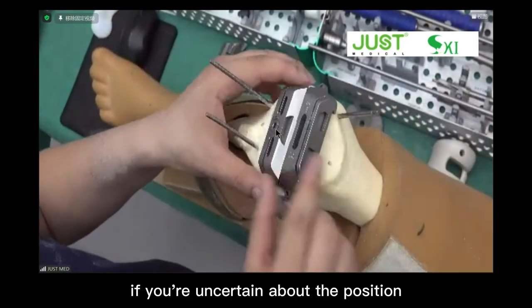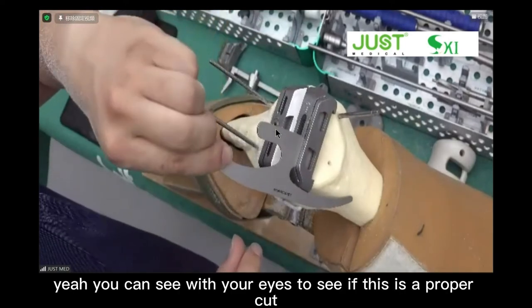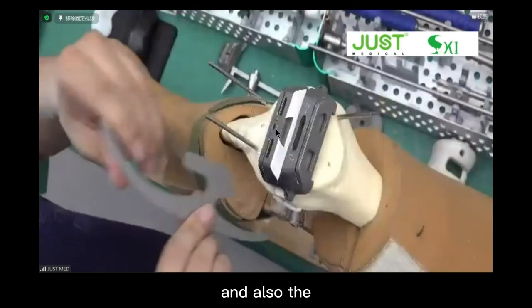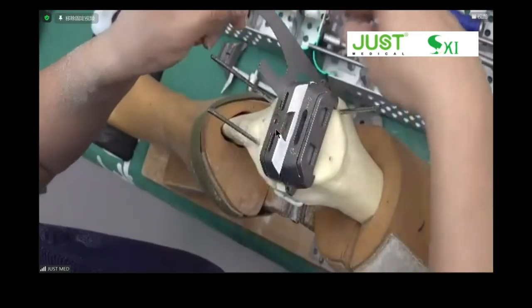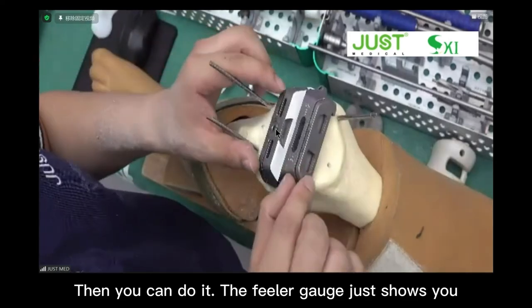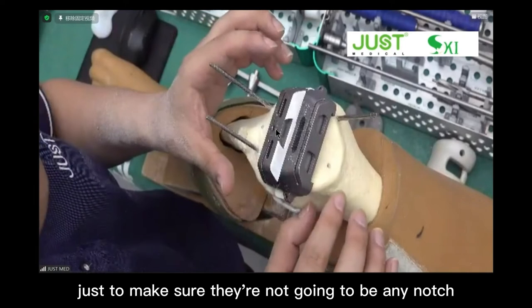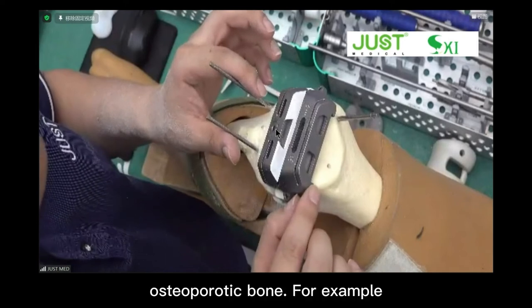If you're uncertain about a position, you can use a feeler gauge. You can see with your eyes whether this is a proper cut here, and also the posterior part. If it seems all right, you can proceed. The feeler gauge just shows you how much bone you will remove after the cut, to make sure there are not going to be any notches, because a notch could be catastrophic in osteoporotic bone.